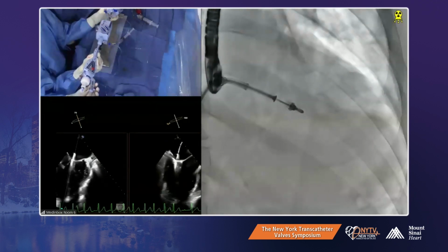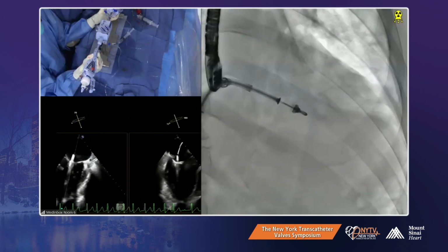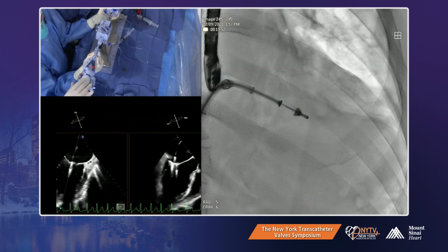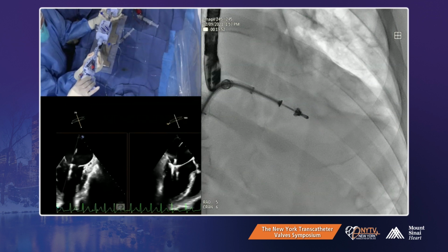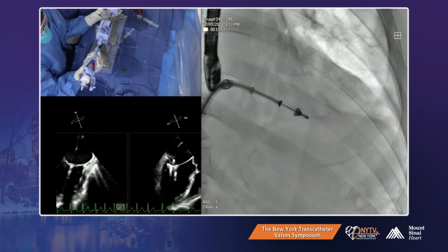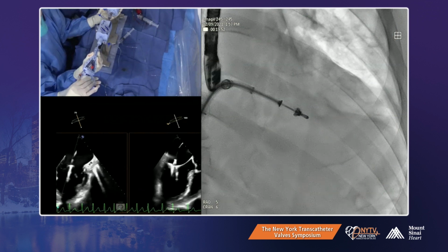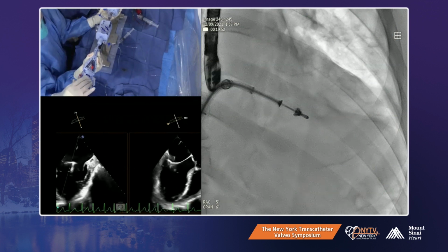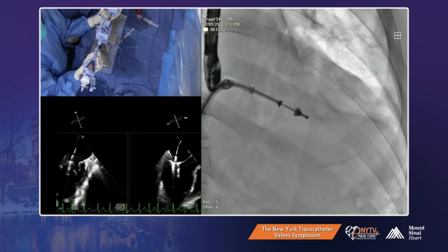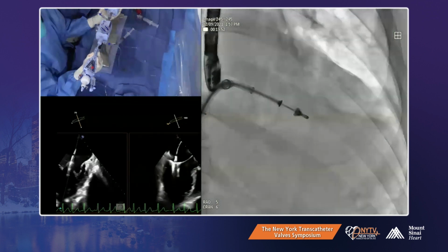It was mainly a posterior central jet. Can you show us better, please? You only show us anterior. Open a little bit. We're all the way to the annulus. You lost it. I know, because you're shadowing, and I need to see the posterior to make sure, because I'm keeping the posterior guide top, and it's not going anywhere. So either we're going against the annulus, or we're not seeing enough of the posterior. Ready?